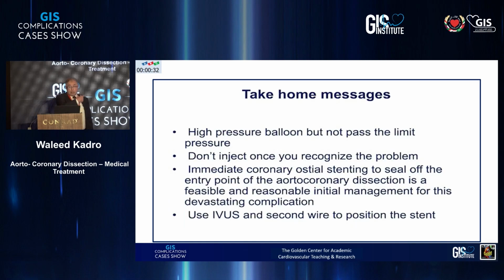Okay, so these are the take-home messages. When you use a high-pressure balloon, try to find what's causing this, and don't inject, and everybody knows about that. Assess the entry point, and use the IVUS if the patient is stable to assess the mechanism.